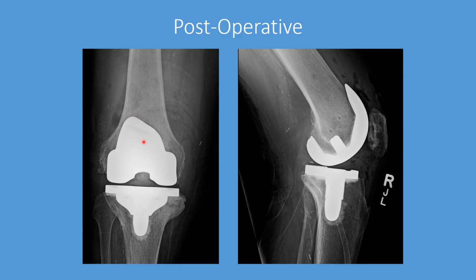So if you remember our knee previously, and I'll show you another image of that, we want to make sure that the femur and tibia are aligned, that we have an even spacing between femur and tibia. And in this knee, we've used a universal base plate, so there's a little bit more support to increase the volume of fixation along this tibial surface. And we've filled in this 3 mm gap with cement to restore structure where it had collapsed. And this is lateral. You can see we've got appropriate sizing, anterior, posterior, and good cementation and balance.